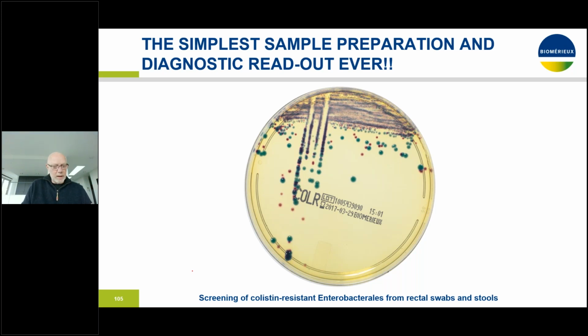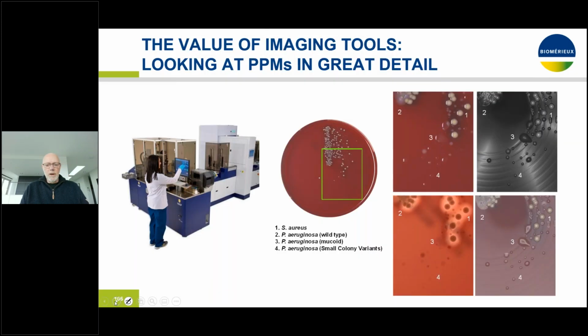And there I also have to emphasize that the plates with the organisms on it should not be thrown into the mass spectrometer without any thought. You need to look at these plates, and also a visual interpretation of the plates can help you to select or to at least include all of the organisms that are important for the subsequent mass spectrometry analysis.